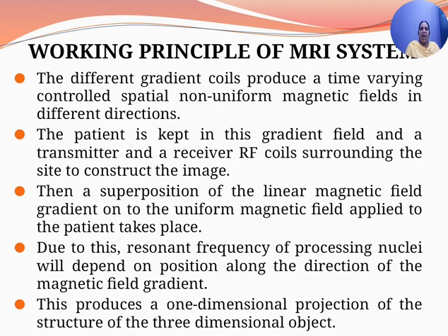So if a certain area of the body is specified, then the RF coils usually become focused on the body part being imaged to allow for better scan. Now the MRI patient table is a component that slides the patient into the MRI machine. The position at which the patient lies down on the table is determined by the part of the body that is being scanned. So the area under examination is placed in the exact center of the magnetic field. That is called the isocenter.